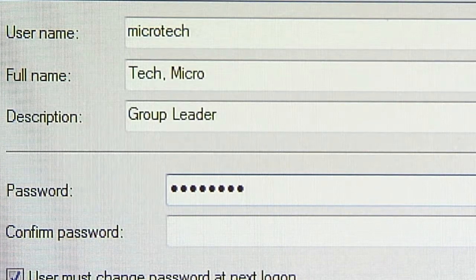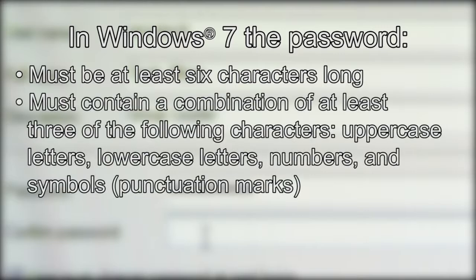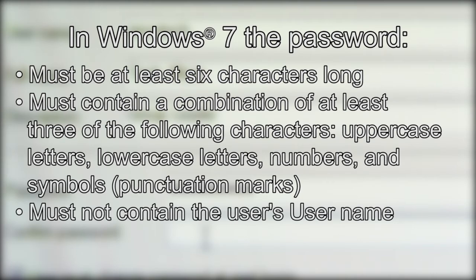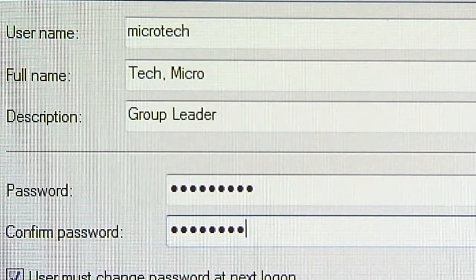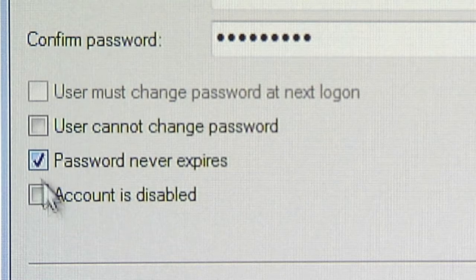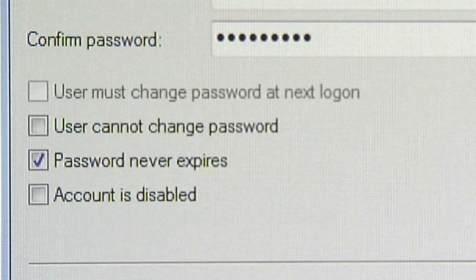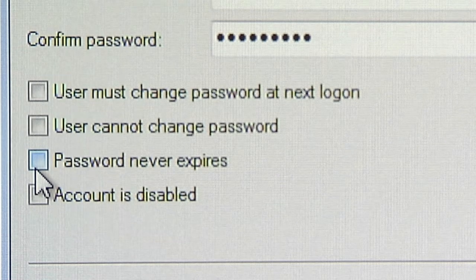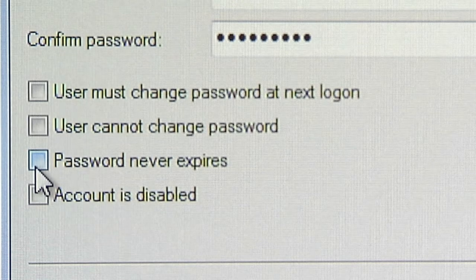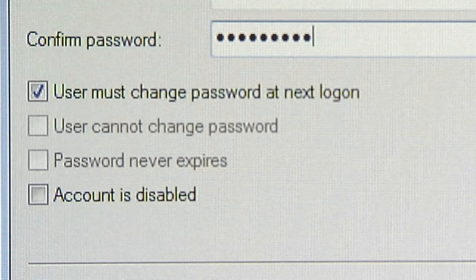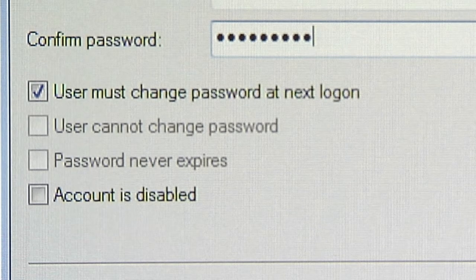Enter a password. In Windows 7, the password must be at least six characters long, must contain a combination of at least three of the following characters: uppercase letters, lowercase letters, numbers, and symbols or punctuation marks, and must not contain the user's user name. Enter the password again to confirm. Uncheck the box 'User must change password on next logon,' and then check the 'Password never expires' box. Be advised that if 'Password never expires' is not checked, the user must periodically log into the Windows login screen and update their password. There is no warning message if the password is about to expire. And if 'User must change password at next logon' remains checked, the user will not be able to access the Vitek 2 system software until after the password has been changed by logging into Windows.